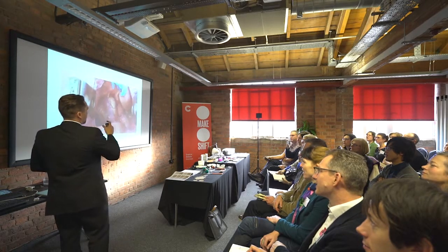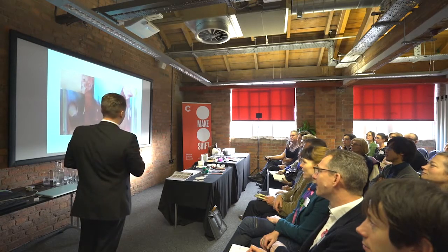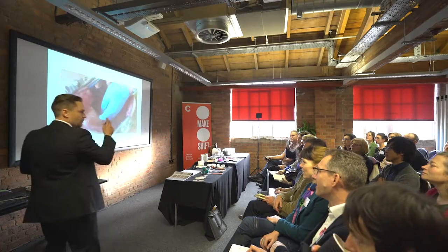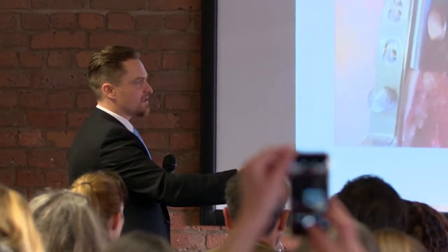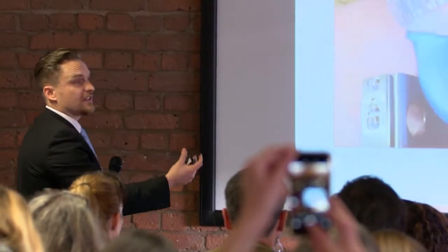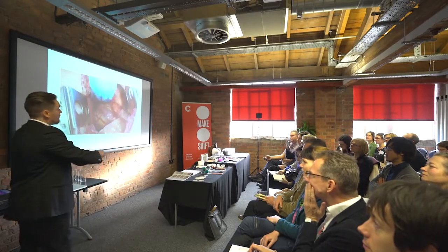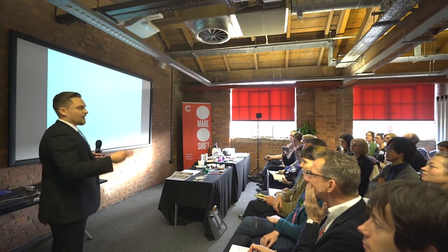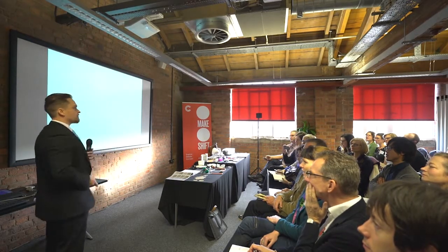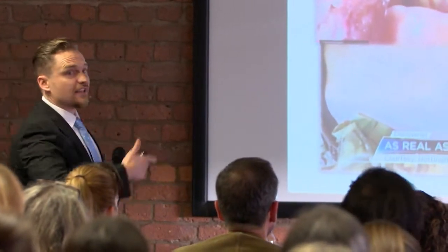And it's not just a craft exercise, this is craft underpinned by science. So what we've essentially got is all of the data taken from a living person, from that CT, and then we've developed that, processed it, so then we can recreate it using craft techniques, using manufacturing techniques, using the experience of surgeons, but also, this is all meaningless if you don't design it around a user. So right from the very beginning, our main focus was asking the user what's possible, what would you like, what is usable, and how we can actually make this thing even more real.